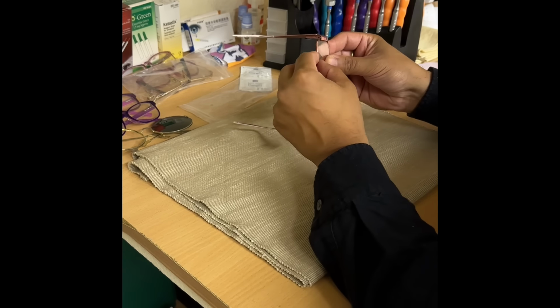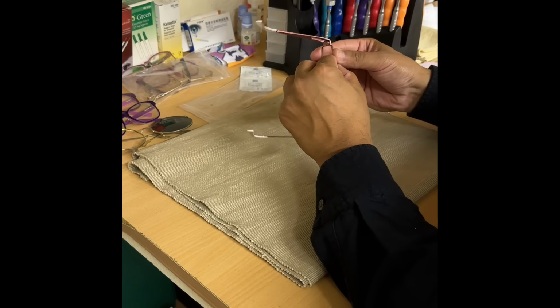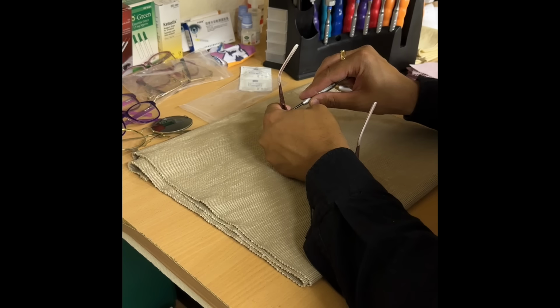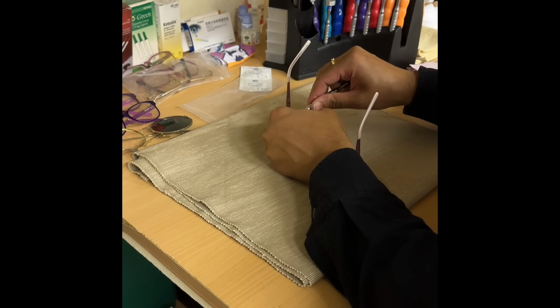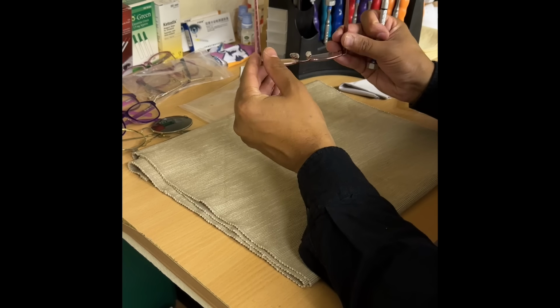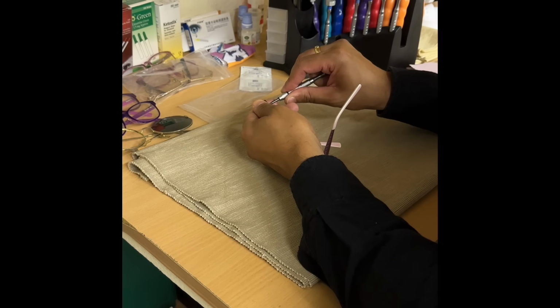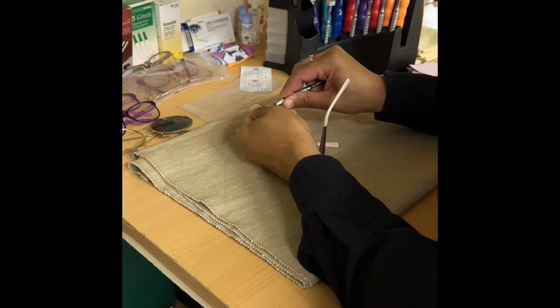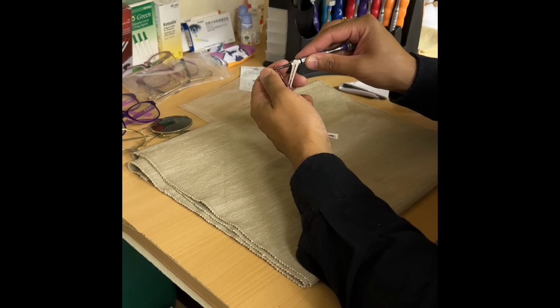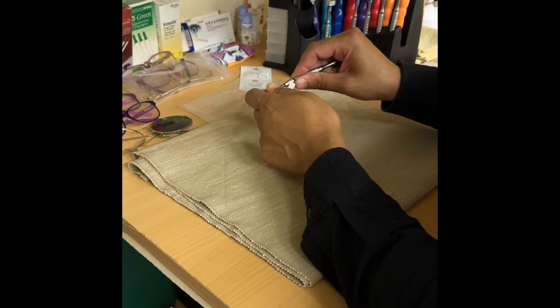There we go. Sometimes you have to completely detach the joint there. And let's see if the thread is still present on the screw here. Looking good. Yep, thread is there, lovely. I'll do the other side to guard against the same issue. Nice and tight there, lovely.